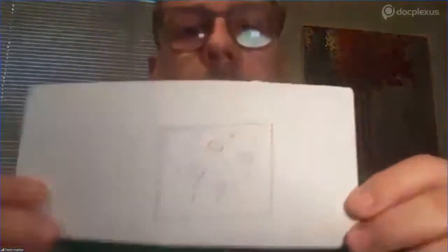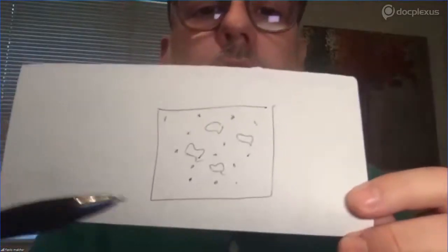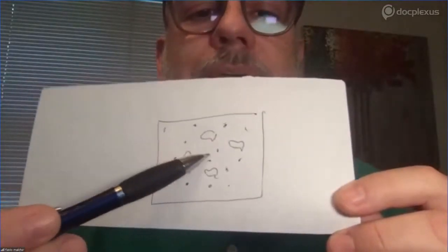But the tip for me is, I don't know if you can see this, but if you have those little holes, you can imagine that my rectangle is my mesh, and I have those holes. I just put the mesh and tack around the hole. I just want to seal the space between the mesh and the peritoneum. I don't want to leave a dead space, because when you leave a dead space, you can have an internal hernia. So now you're using IPOM mesh. There is no issue. The contact is no longer an issue, but the issue is the big pocket you created. So I like to put IPOM mesh, but just tack the peritoneum back against the wall, against the mesh and the wall, to kill that dead space.